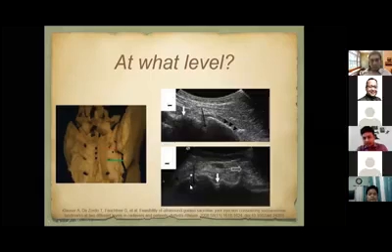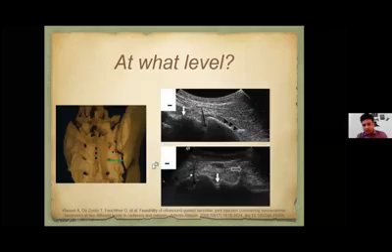And in this lower figure, you can see this is the medial sacrum. This is the lateral crest of the sacrum. Then you appreciate the S2 sacral foramina. Then you move a little lateral, and you will see the sacroiliac joint. So this is how we do it. I try to do it at the level of the S2 foramina because it is a little easier. The depth is a little less as compared to the S1 foramen.